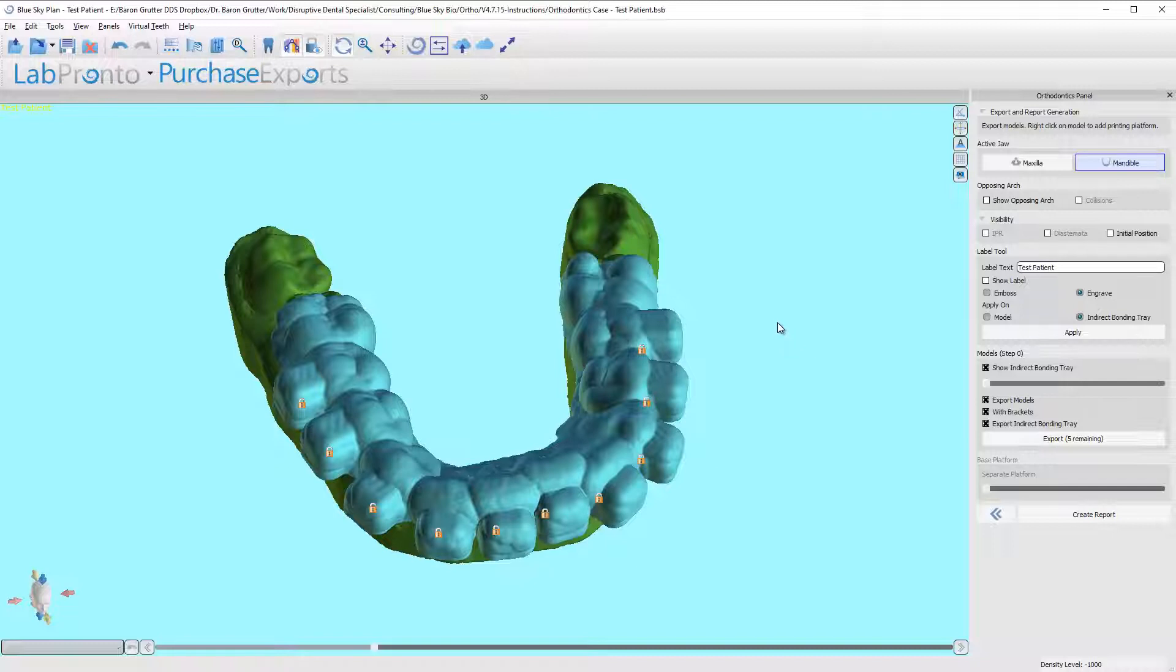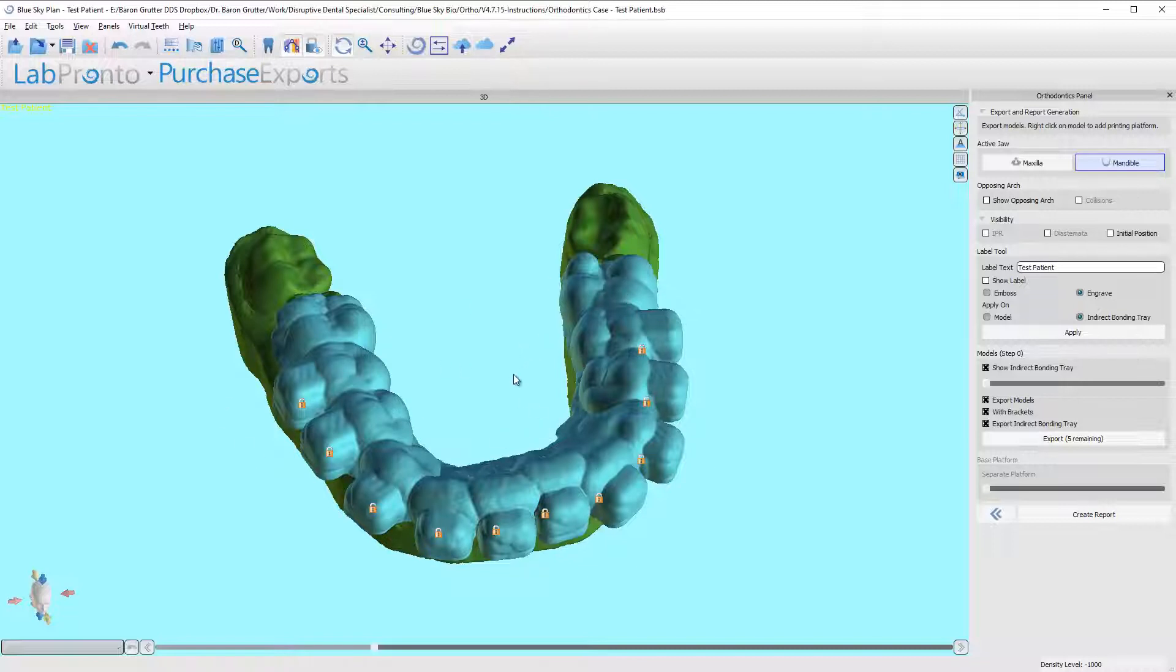But the in-between models will not be helpful to you because at no point will they actually work. And what I mean by that is you couldn't make a tray off of a future model because the way the teeth align are not going to be the way the software sets it up for aligner movement. The sequence of which the teeth move in braces is going to be different.